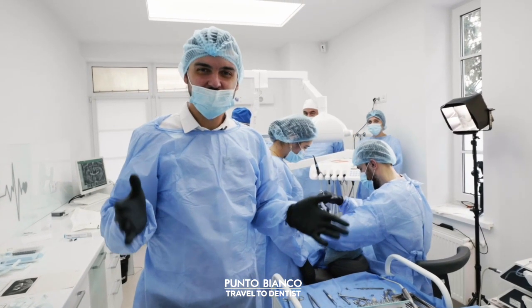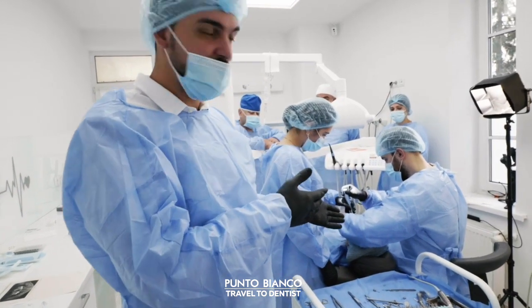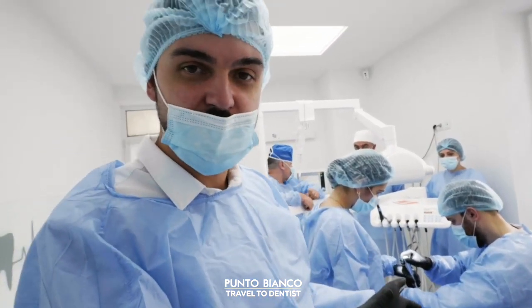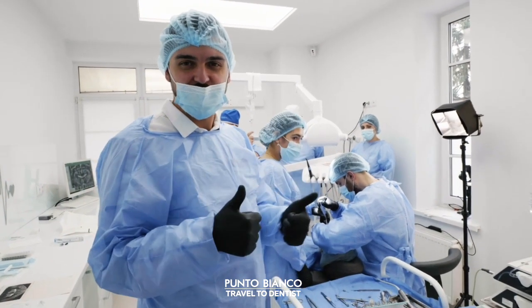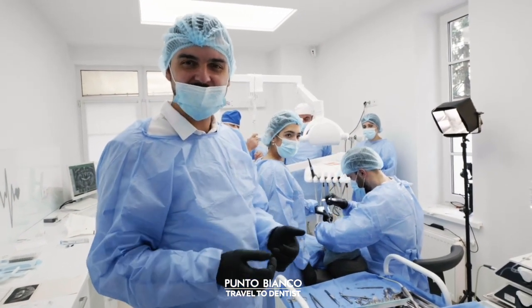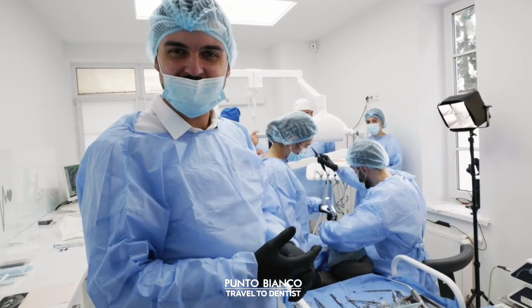So our intervention is almost over, not just the surgery, but also the prosthetic part. The prosthetist doctor is fixing the prosthesis that I made before the surgery and everything is great. We're waiting for the patient to wake up so we can take the final pictures with her teeth in her mouth already.